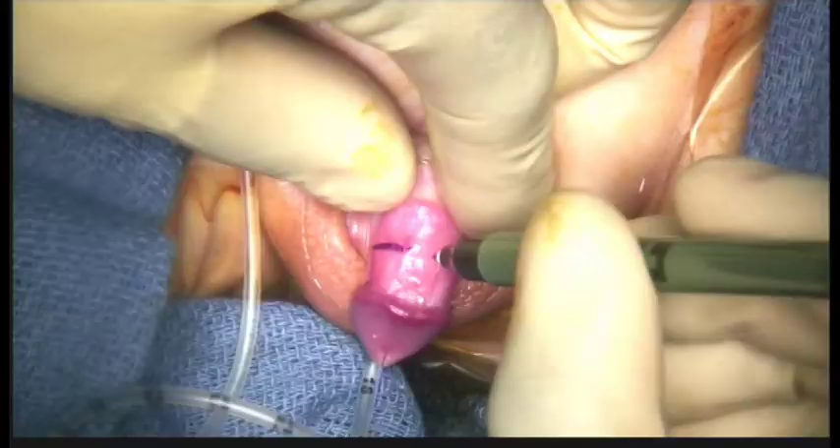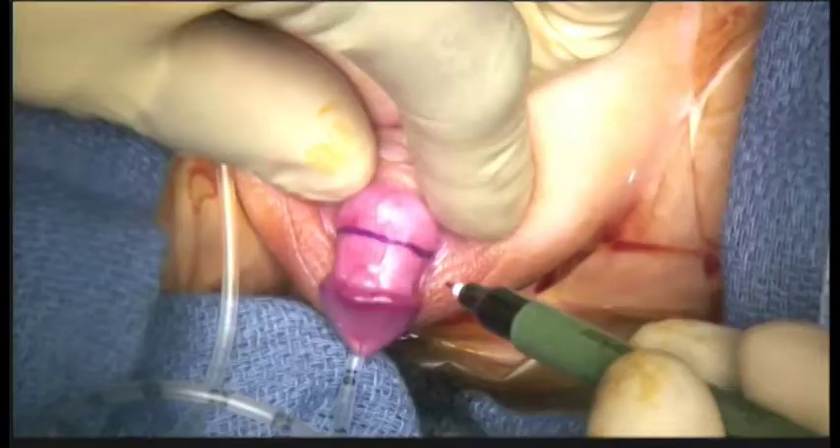Peeling back of the foreskin reveals the full extent of the glans. A holding suture in the glans is a useful assist for retraction during surgery and can also be used to fix the stent in place at the conclusion of the procedure.